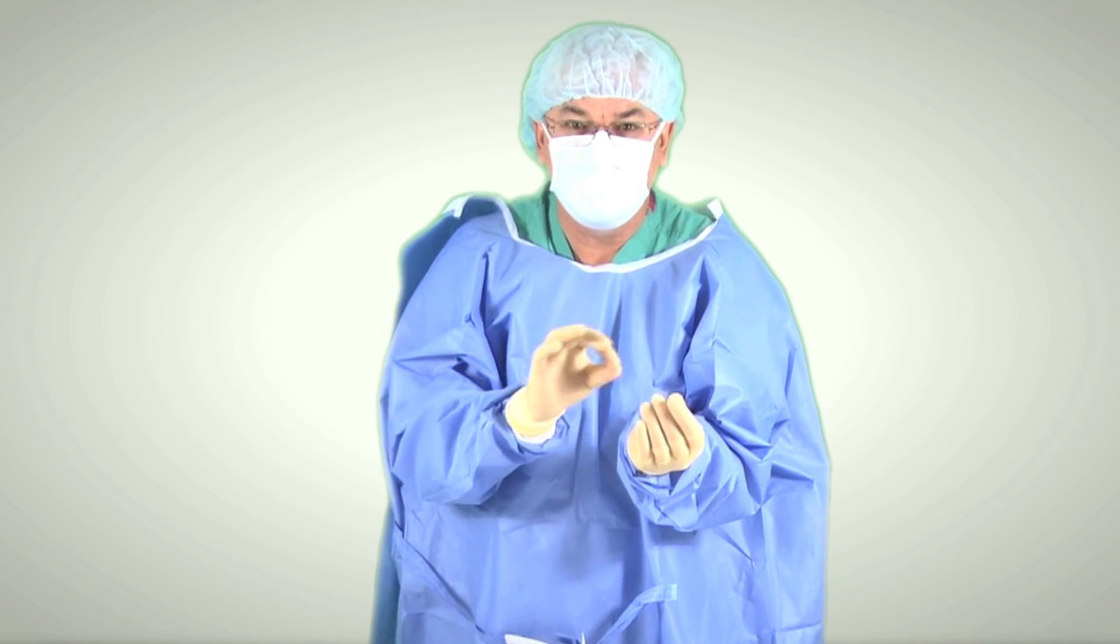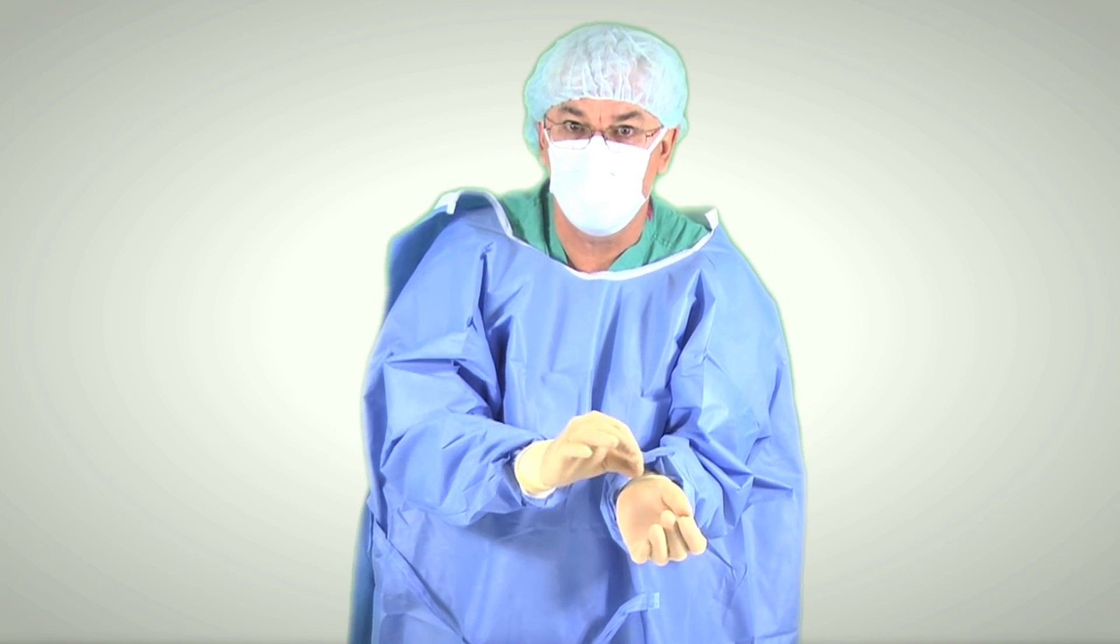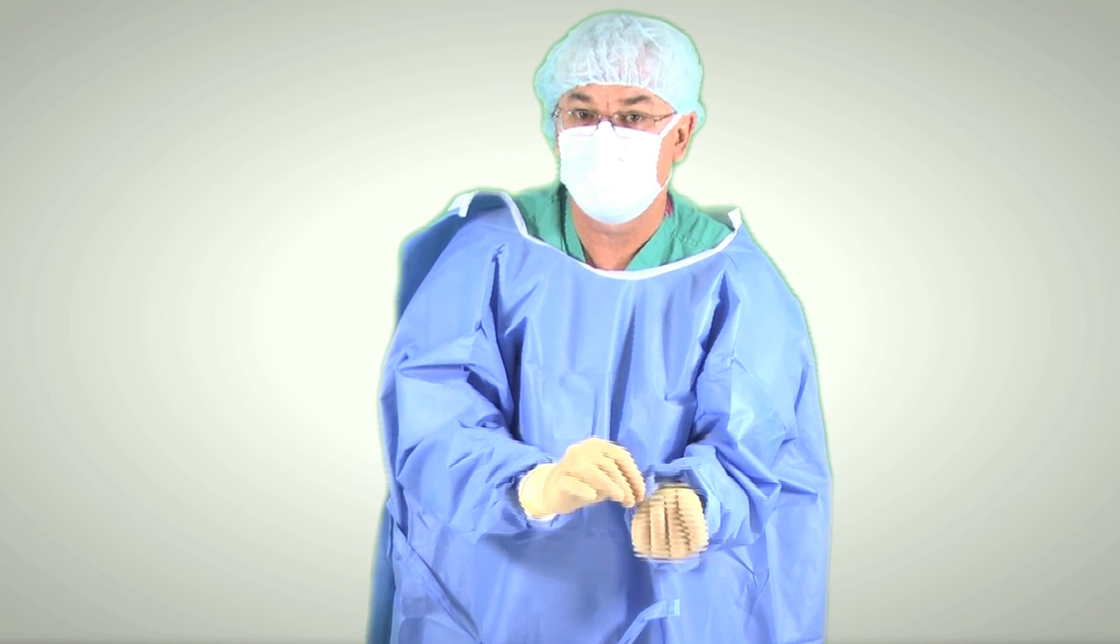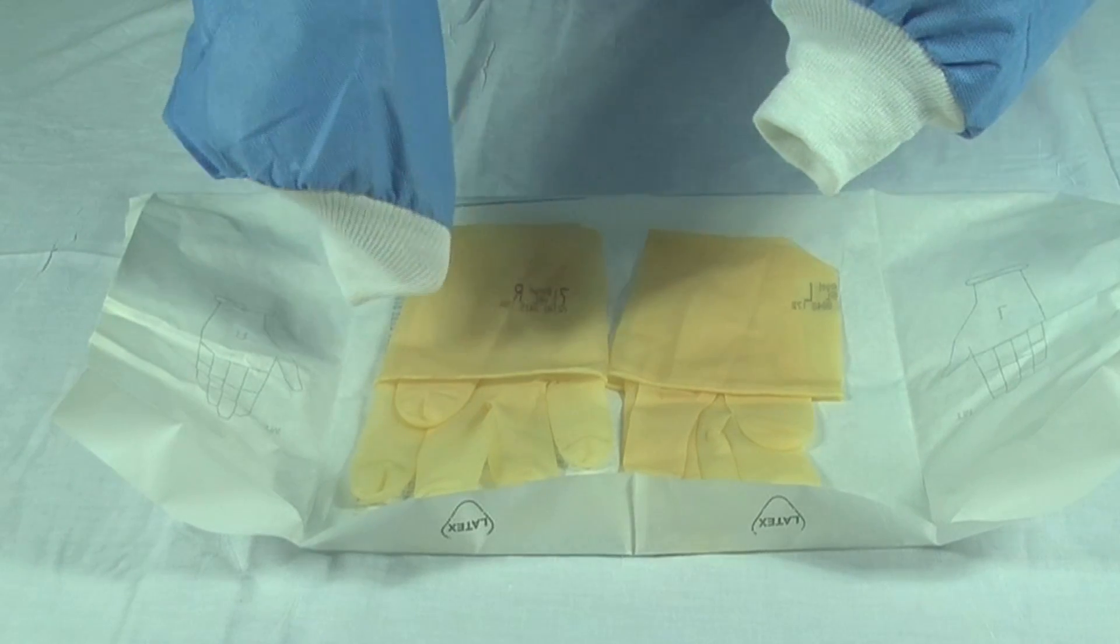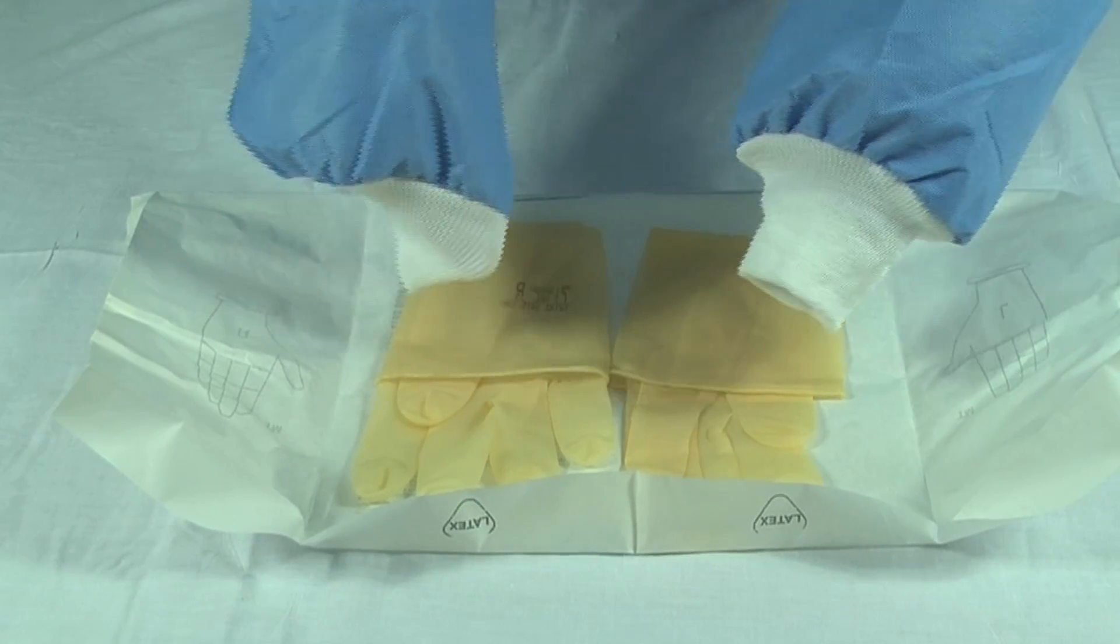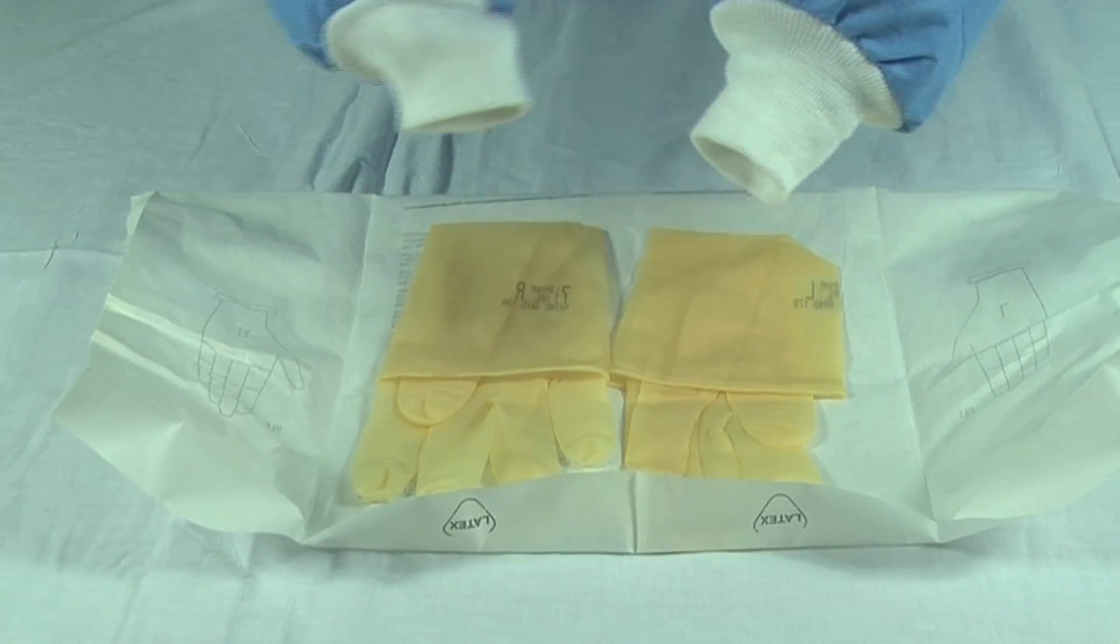Now, I'm going to show you all the little tiny details up close and show you where the little glitches are too. Now I'm going to show you the little bitty details that really go into making sure you glove up correctly and smoothly.